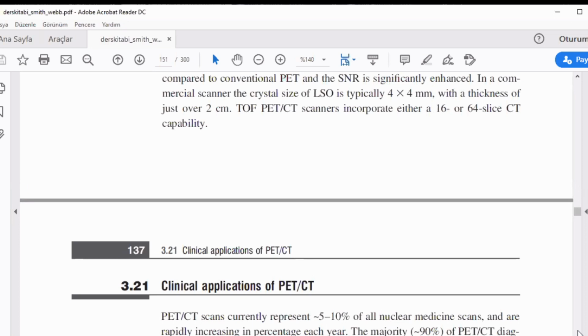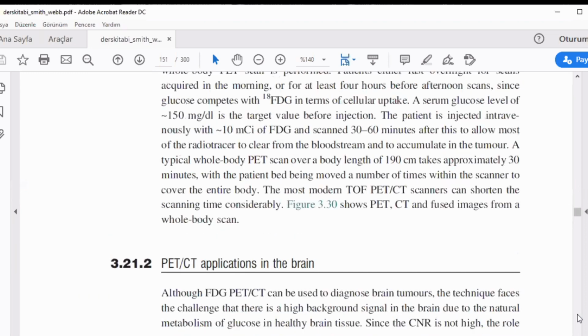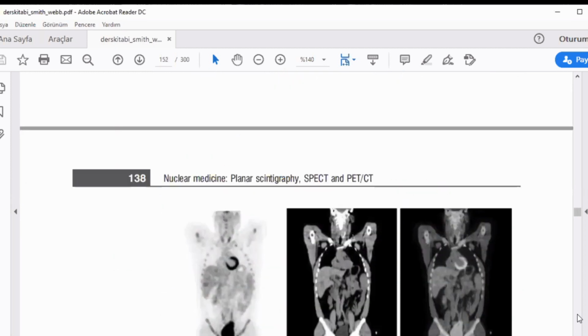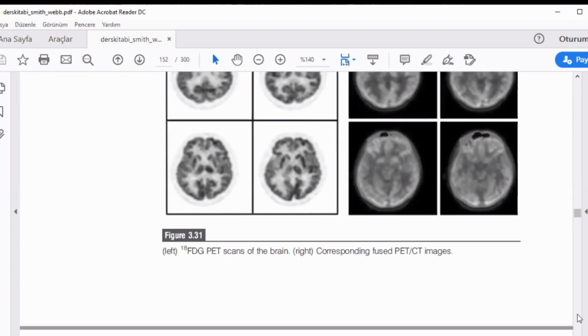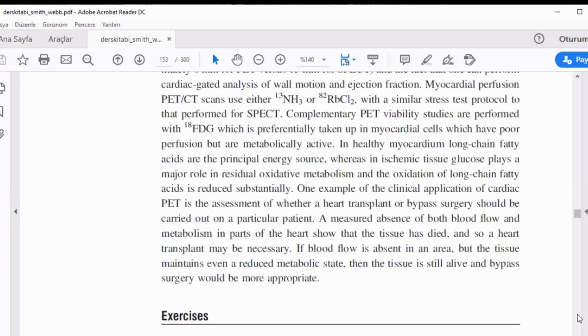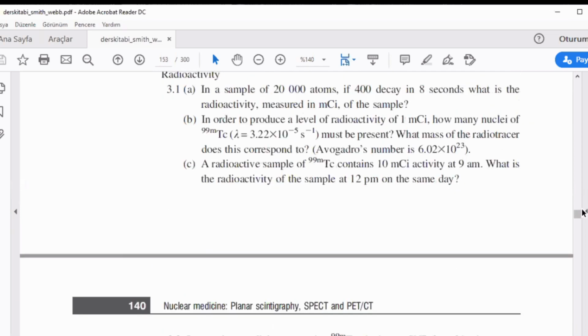It's very similar to SPECT-CT. SPECT is gamma ray below 511 keV. PET-CT is gamma rays of 511 keV and normal computer tomography or CT scans and their images, cardiac images, brain images, etc.